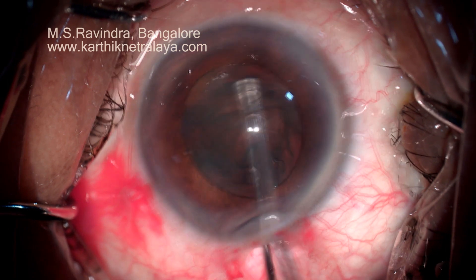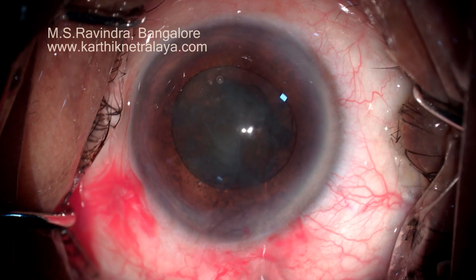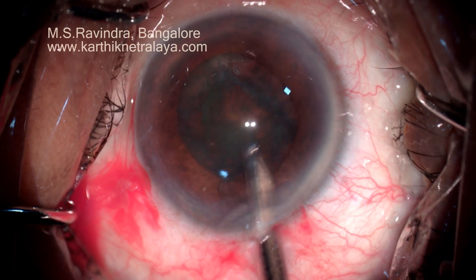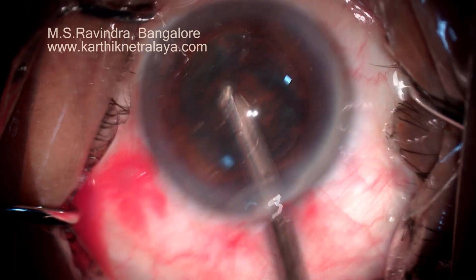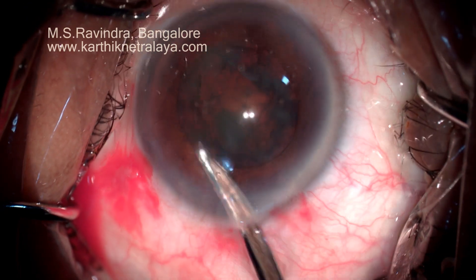Hydrodissection is done separating the capsule from the cortex. The nucleus-epinucleus mass is rotated clockwise and anticlockwise to loosen the cortex and to facilitate cortical aspiration. The nucleus and epinucleus are not separated from each other.